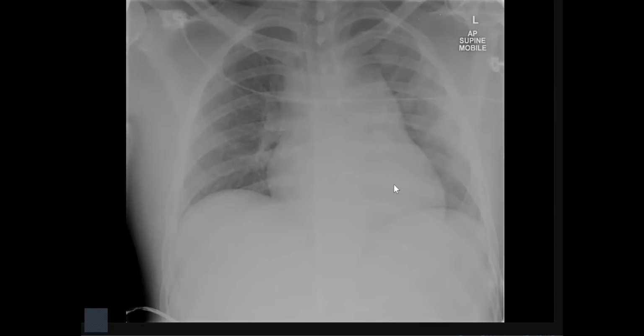I'll stop you, because this is an important point. You described some negatives. Some points you are not sure of, and now you are sure of this. The order of findings is important, my friends. You may face some very hard examiners. Don't say negatives.